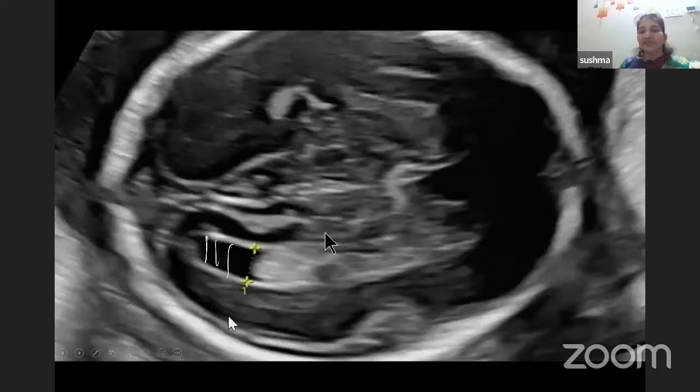This side here is the parietal lobe of the cerebral hemisphere, whereas this side here is the occipital lobe of the cerebral hemisphere. So this parieto-occipital sulcus marks the partition between the parietal lobe and the occipital lobe. So at this point, we have to measure the diameter of the lateral ventricle.